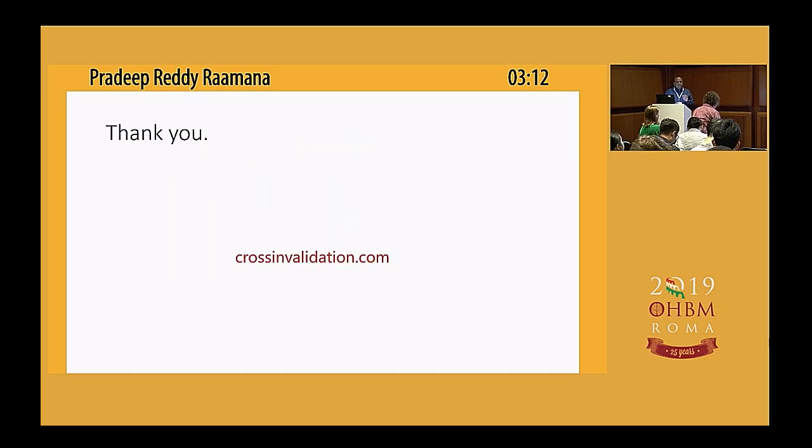So that leads me to the end of the first talk. Any questions? Susceptibility artifacts are a problem even with retainers. We usually do not exclude people with retainers from fMRI experiments. That would actually affect a lot of young students, young test subjects that need retainers. What's the matter with retainers, and why would you recommend excluding them? Have I got you correctly?